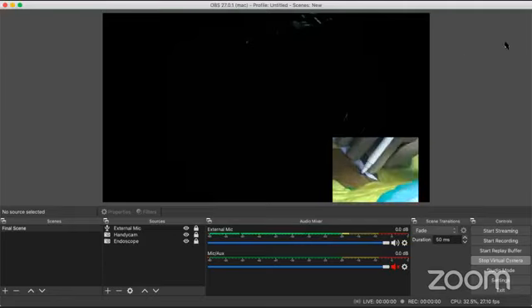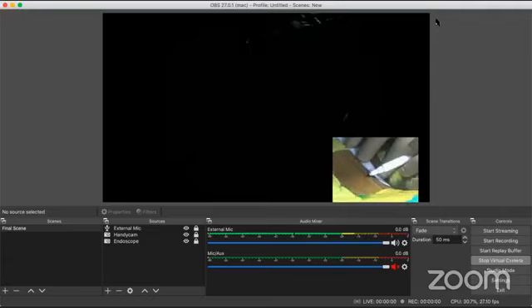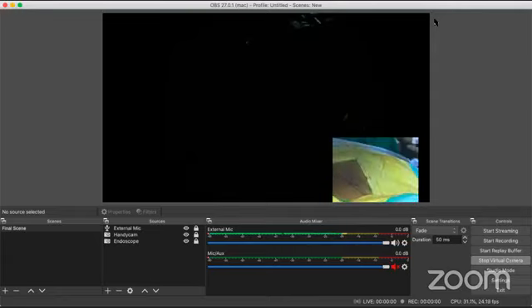From my entry point here, I'm going to focus over here. But at the same time, I'm going to strip till the spinolaminar junction. Okay? I'm going to follow the arc of the lamina. I'm going to come to the facet joint and I'm going to open up the facet joint. So we are going to start now. Can I please take a needle, please, so that I can mark myself carefully? And I can infiltrate some local with adrenaline.